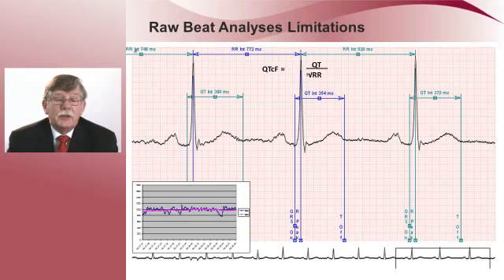And the QTcF is that QT divided by the cube root of the RR interval. So for each and every one of these beats, there's a different correction for that QT. In addition, if you look down at the graph in the lower left, even though the fuchsia line is smooth because there's a stable heart rate, there's still beat-to-beat variability, as I mentioned above.